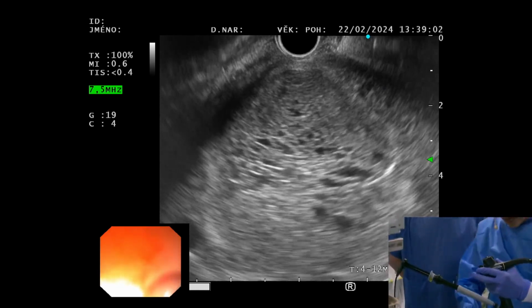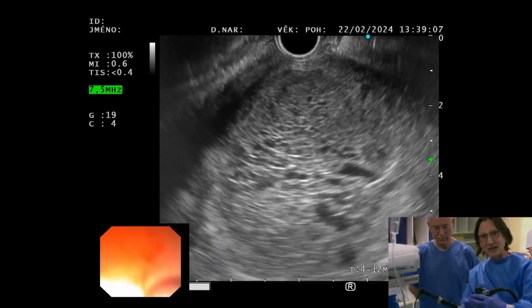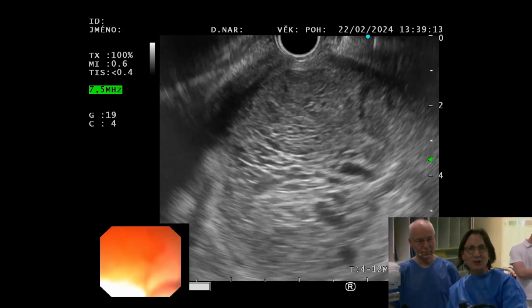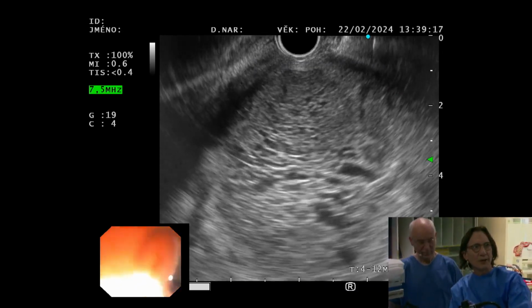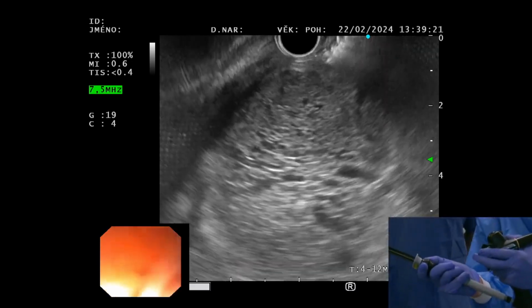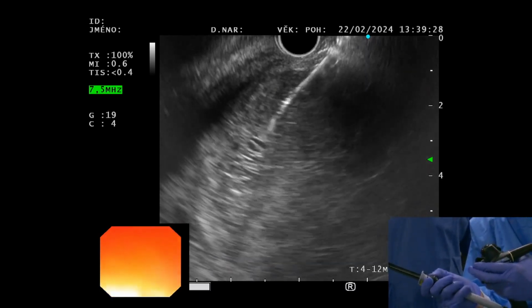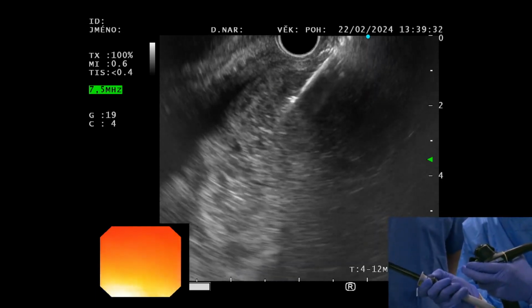And I've confirmed that. And this is not an FNA. This is a puncture of a pseudocyst. So I use the acronym SSS, which is slow, steady, smooth. The most important is the slow. So I'm pushing gently here, and I'm stepping on the yellow pedal, and I'm slowly going in. There it is. I can follow it as I push it all the way in like this. I can see the very tip of it. I'm pushing in.